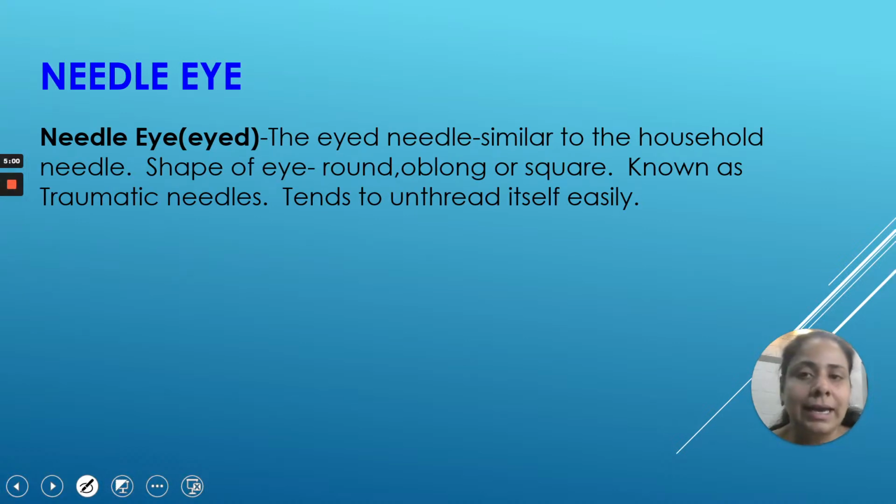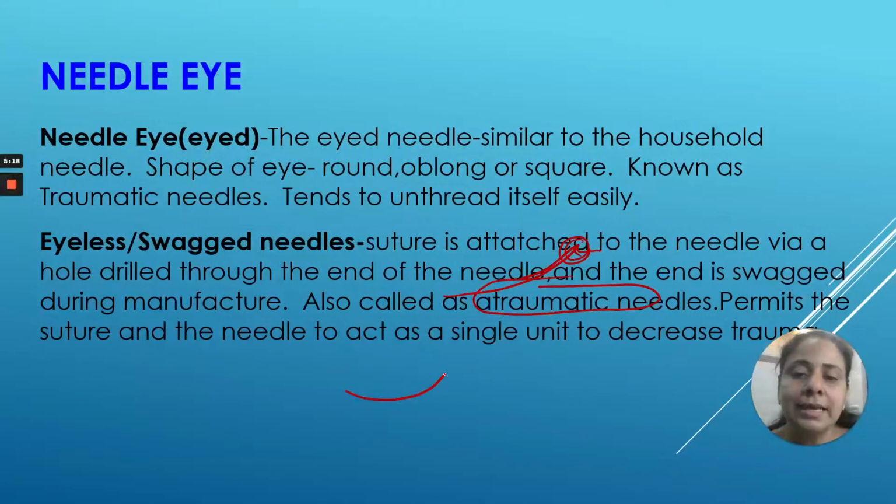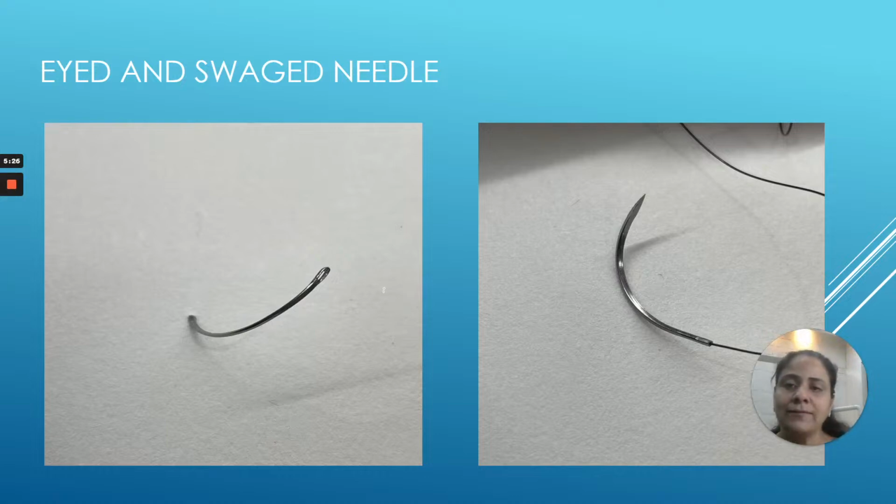So what is a needle eye? Again, I have told you that this is the needle and there is a small eye over here. So we put the thread in, we knot it. And there are swaged needles also, and these are atraumatic needles, totally atraumatic needles. In this case the needle and the suture thread are one in nature. These are the most commonly used ones. So these are the photographs of the eyed and the swaged needle. You can clearly see an eye over here, and you can see we put the thread, we make the knot, and we do the suturing.